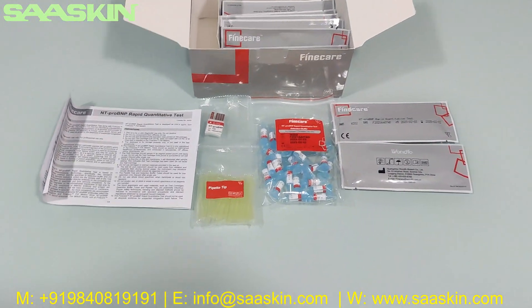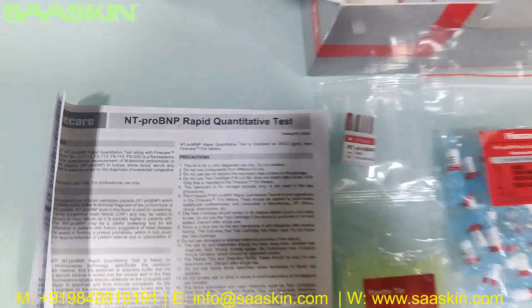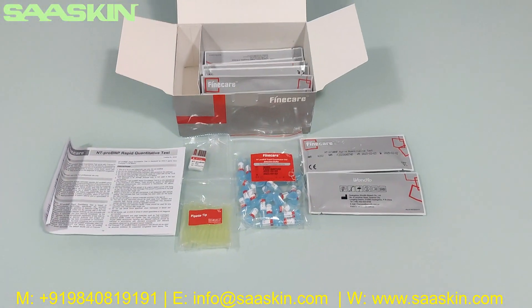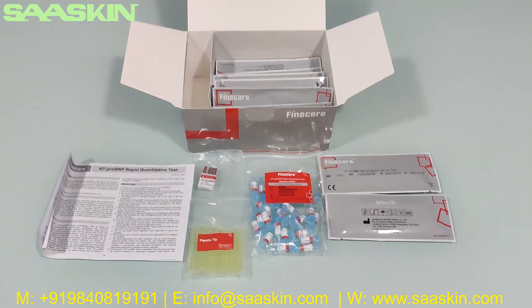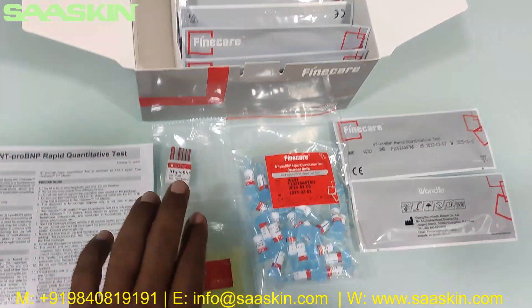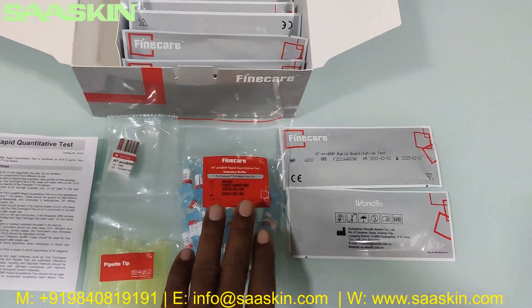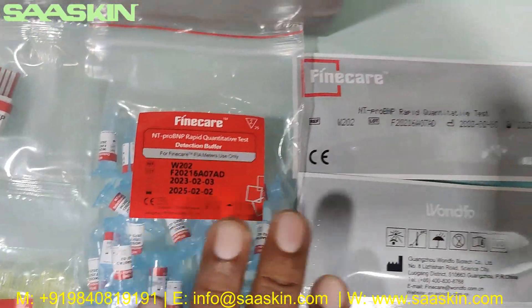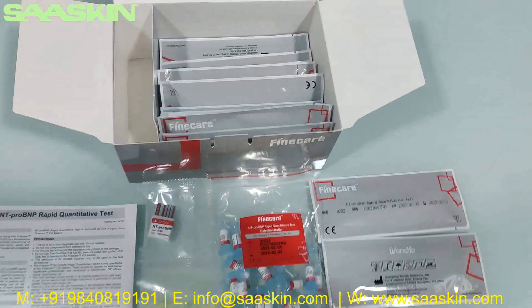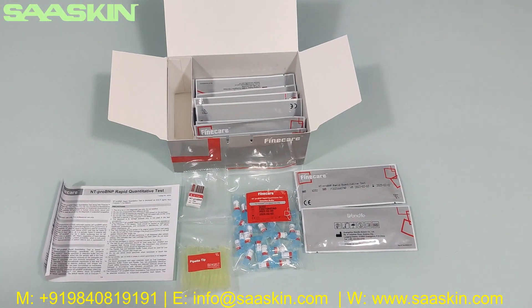So today we have seen the unboxing of the Fine Care NT Pro BNP Rapid Quantitative Test. To quickly summarize: this is a 25 test kit pack. In each kit pack you have one instruction manual, 25 pipette tips, one ID chip with the lot number, 25 detection buffers, and 25 test cassettes. So this is a complete kit. Thank you.